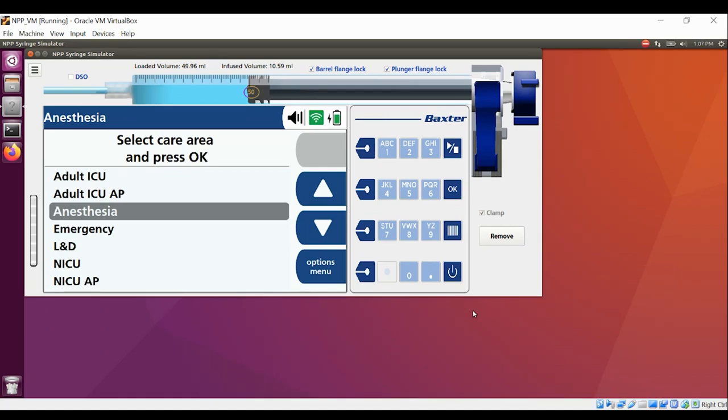They may say we're always going to start at 100 micrograms per kilo, and so therefore, we'll always have that pre-programmed. Good to have that pre-programmed in your loading dose and bolus dose as well. If it's not there, you can just remind them that when they set up their library, it's important for them to participate so that they can get those parameters pre-programmed for them to reduce the number of steps.